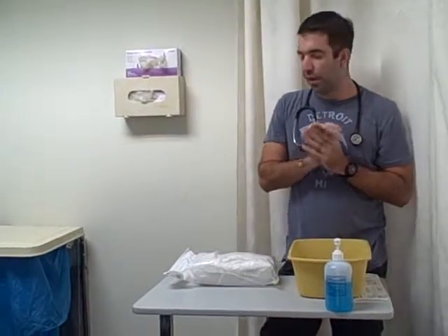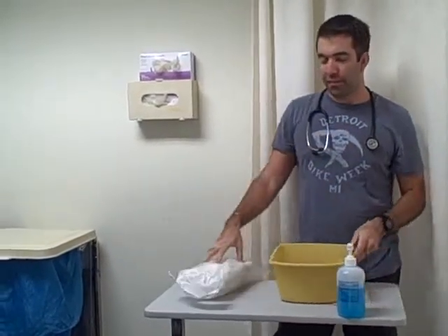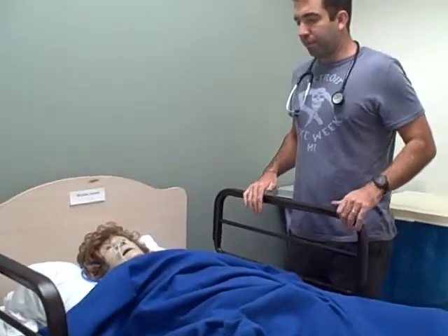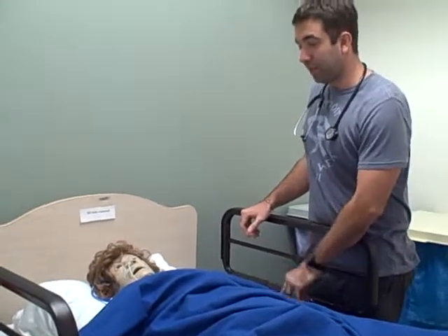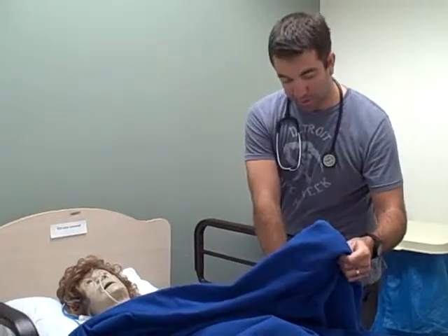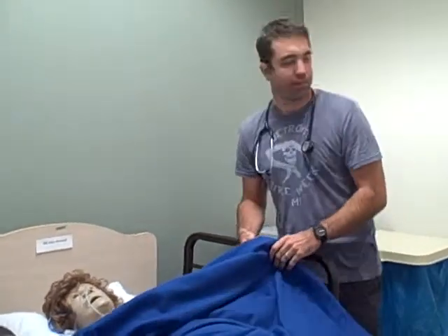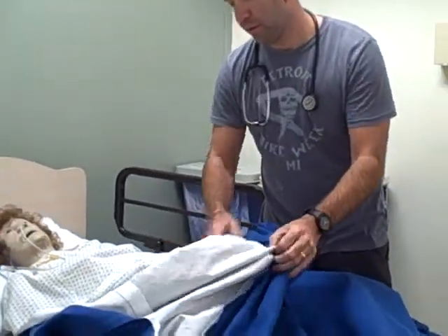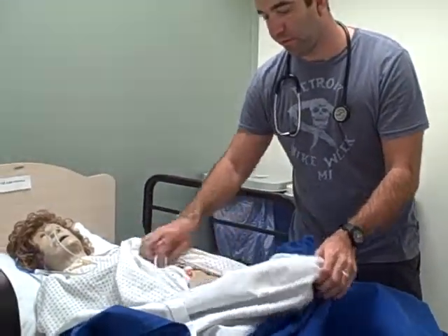Okay, so then I'm moving on to the straight catheter section, the male straight catheter. And so I'm going to enter the room, wash my hands again. Make sure that I have privacy for the patient. Make sure I identify the correct patient, and the patient tells me his date of birth, and make sure that he has the correct medical number. Next thing I want to do is expose the penis area.